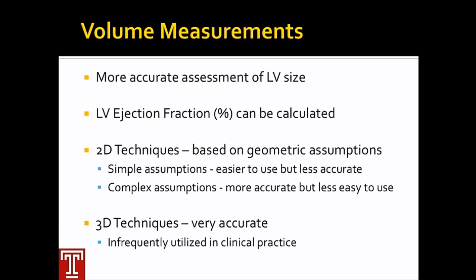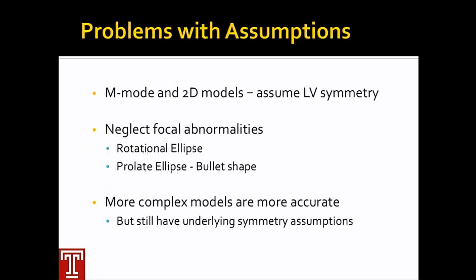There aren't too many guidelines with regard to LV volumes by 3D quantitation techniques, so I would not expect that you would see anything about that on the exam. 2D techniques, as I said, make assumptions. The simple ones make more assumptions than the more complicated ones. And I won't go into great detail about the problem with making an assumption. You all know what the major problem there is.